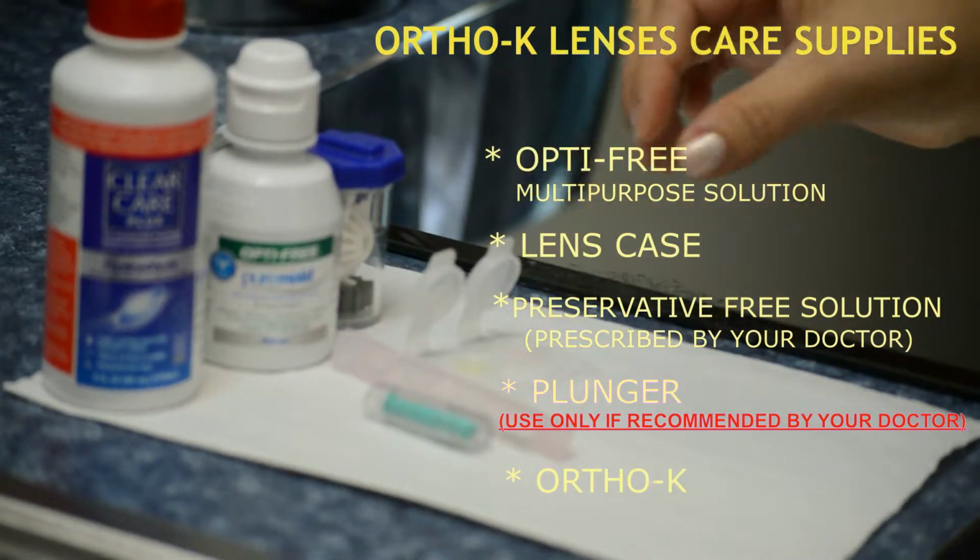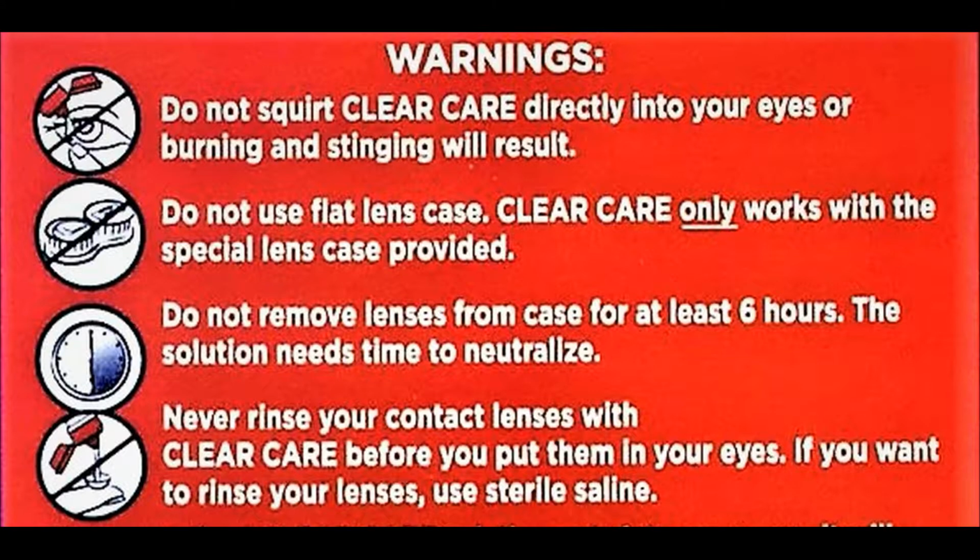And finally, your Ortho-K lenses. Keep in mind that your clear care solution is only to disinfect and not to rinse your lenses. Do not squirt clear care directly into your eyes, or burning and stinging will result. Do not use a flat lens case. Clear care only works with the special lens case provided.